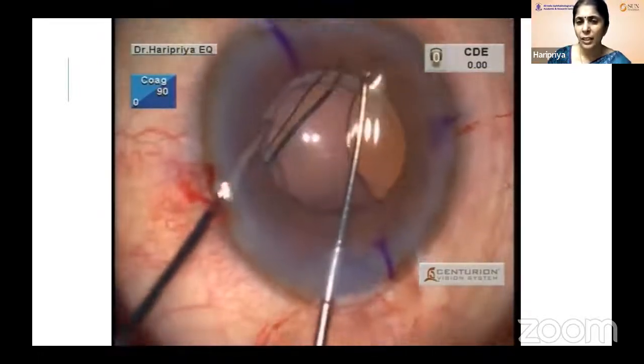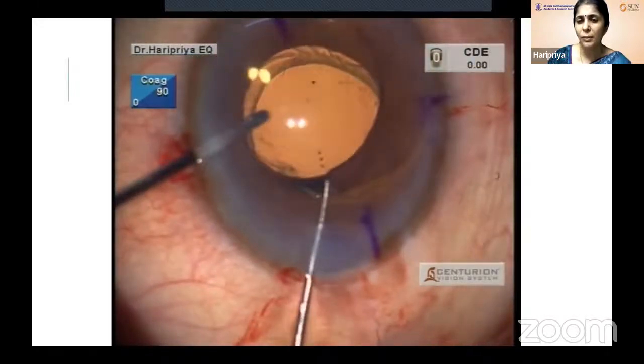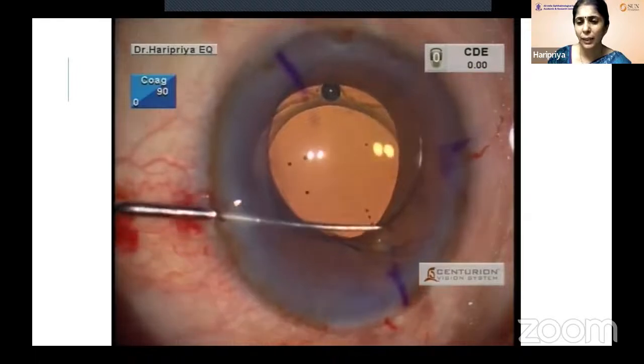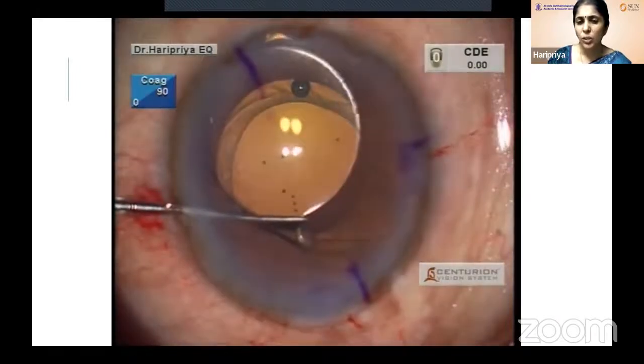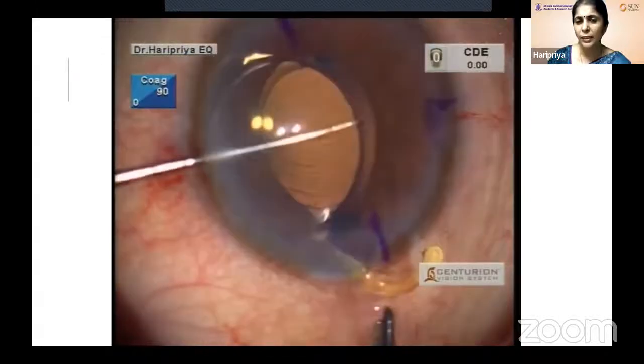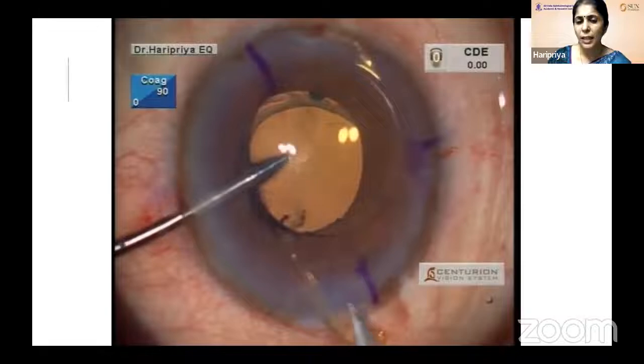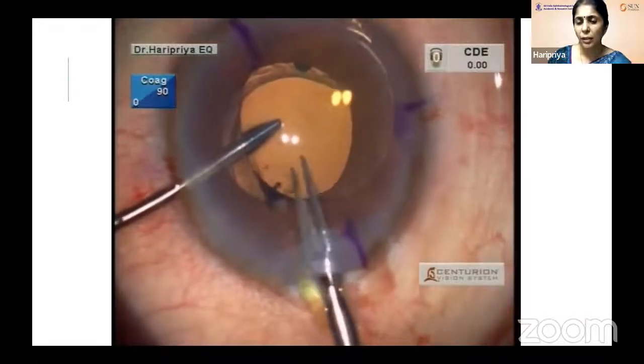So you have adhesions either between the anterior capsule rim and the optic, or more dangerous if you have it between the haptic and the capsular bag equator. So here 2 instruments are used to bring the IOL into the anterior chamber. The IOL is grabbed using a micro forceps, and then the IOL is cut into 2 halves.